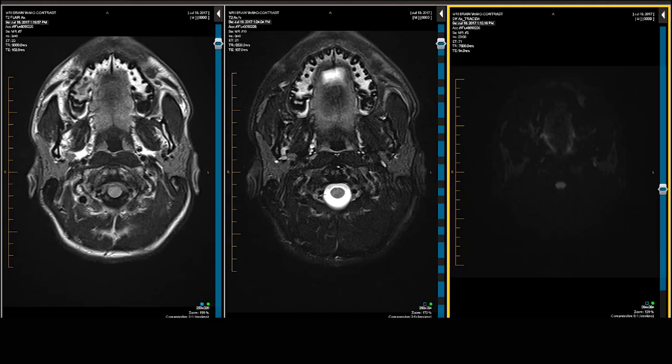This is a young woman being evaluated for follow-up of known multiple sclerosis. When looking at scans for multiple sclerosis, I generally have up initially the axial FLAIR scan, the axial T2-weighted scan, and the axial diffusion-weighted scan. I scroll through these in order to identify the demyelinating plaques in the axial plane initially.